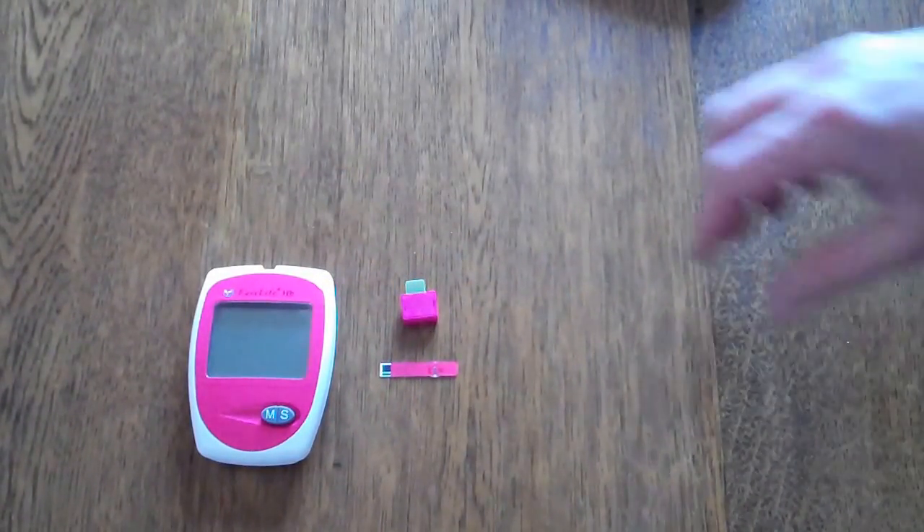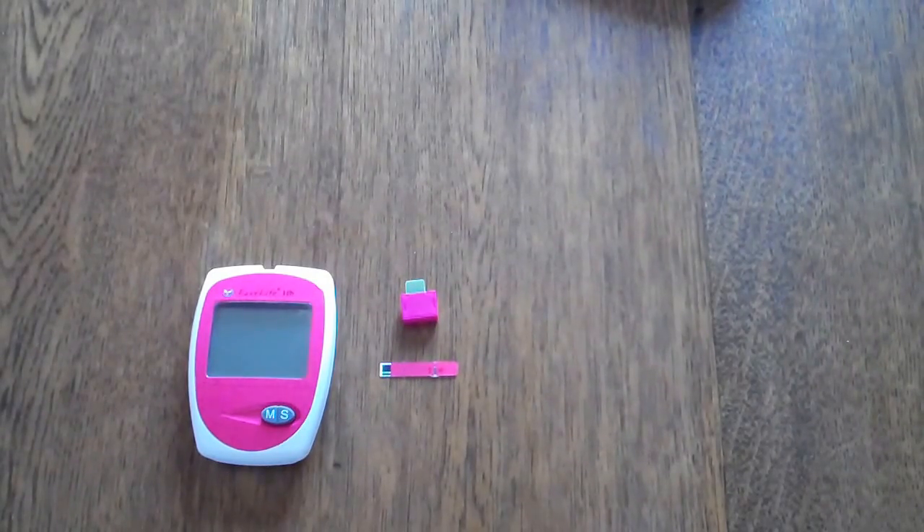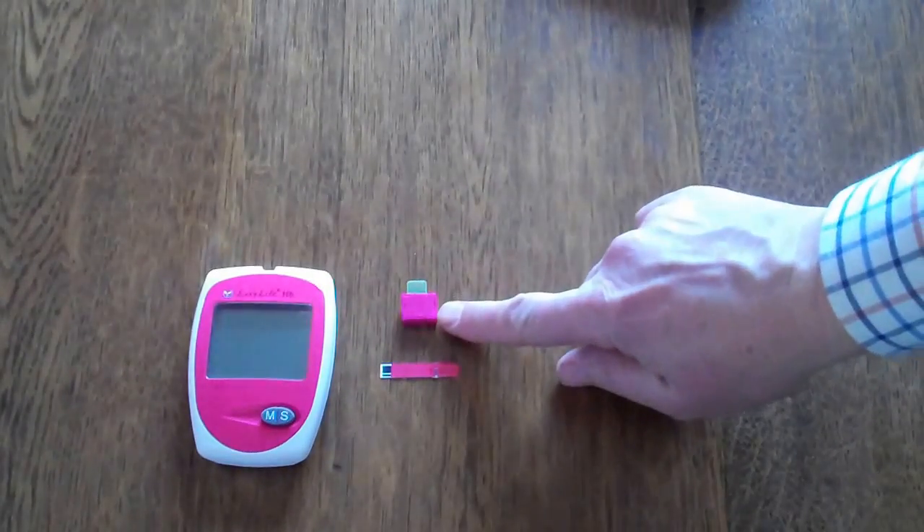Here we've removed the meter — this is ready to go with batteries fitted. When you first fit the batteries it will ask you to set the time and date, so the memory function will record these together with the results of the haemoglobin tests. Each pack of test strips comes with a code chip.